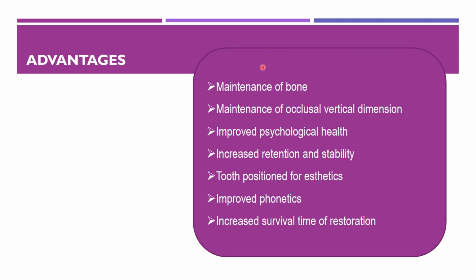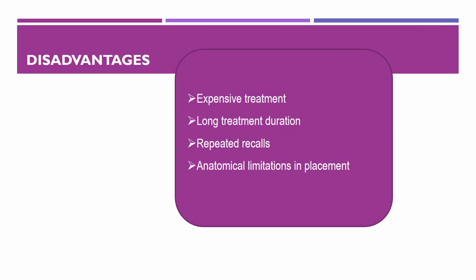What are the advantages? Obviously, there will be maintenance of bone, maintenance of occlusal vertical dimension, improved psychological health, increased retention and stability, tooth positioned for aesthetics, improved phonetics, and increased survival time of the restoration. Coming to the disadvantages, obviously it is expensive. Compared to other treatments, it is very expensive and a long treatment duration is needed. Repeated recalls are always necessary for the longevity of implant success, and there are anatomical limitations in placement.